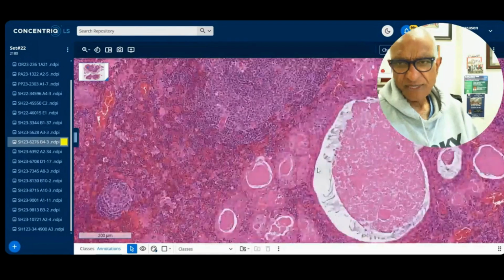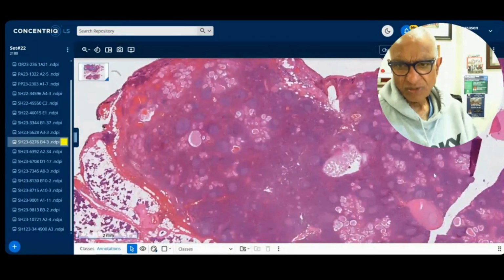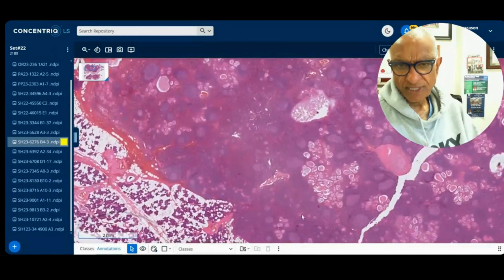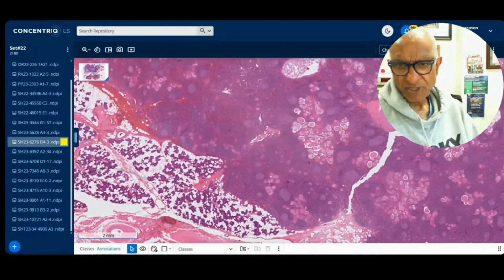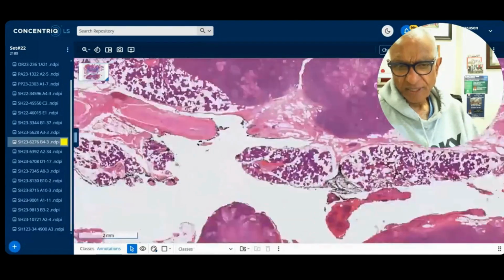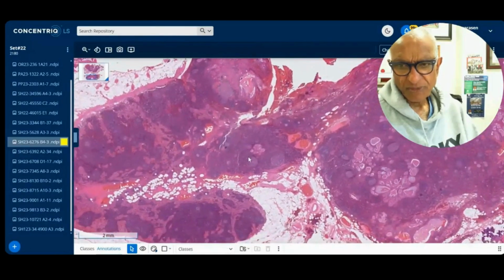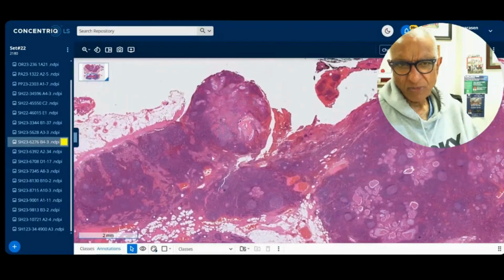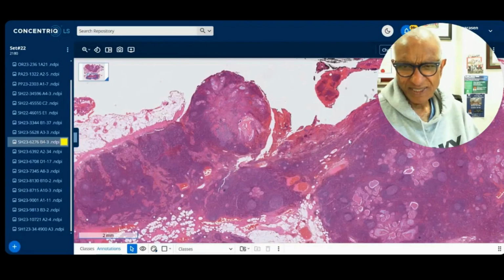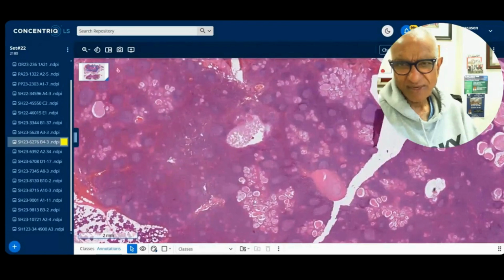Okay, now that's pretty much it all over this nodule, lymphoid, as well as these pink collections of cells all over that. And then here the same thing. This has just been bisected. Now that I'm looking at it in low power, it's almost sort of like a lobular configuration. I never realized that, but yeah, it does have a lobular-like configuration.